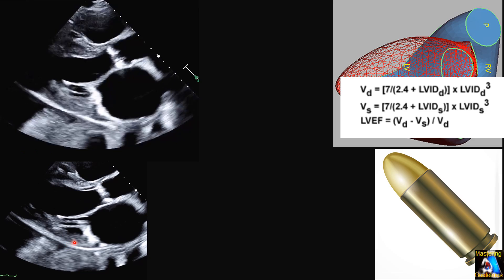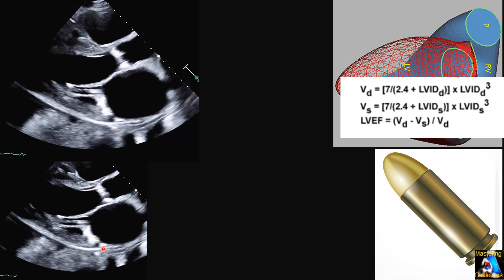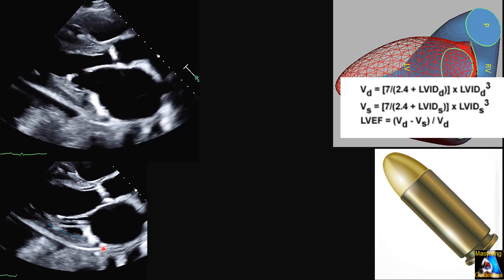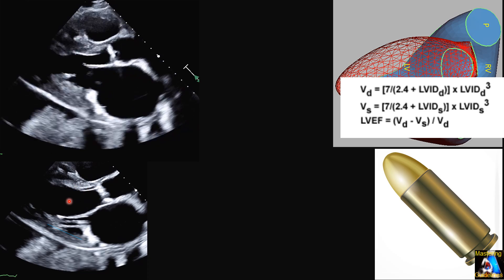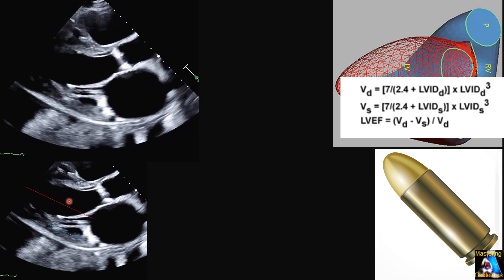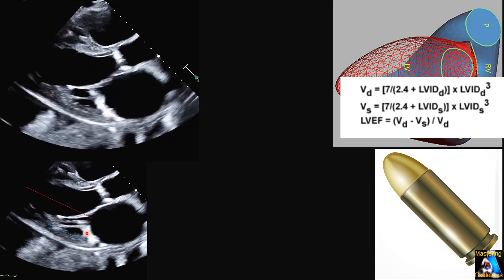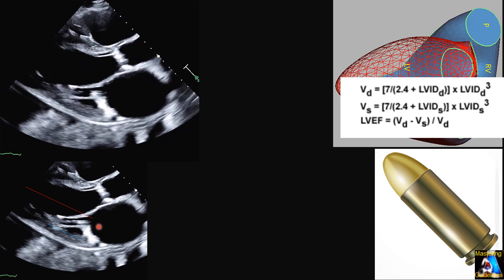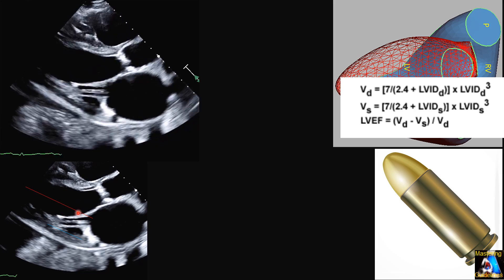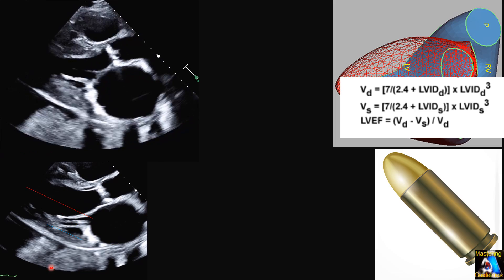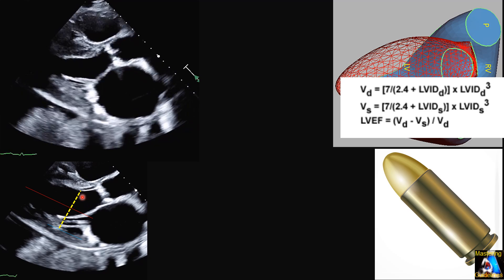When we find the compact endocardium of the posterior wall, at the end of diastole — between Q and R — we identify the point with the largest diameter. After determining the compact endocardium of the posterior wall and septum, we draw a line between the two papillary muscles, perpendicular to the left ventricular long axis.